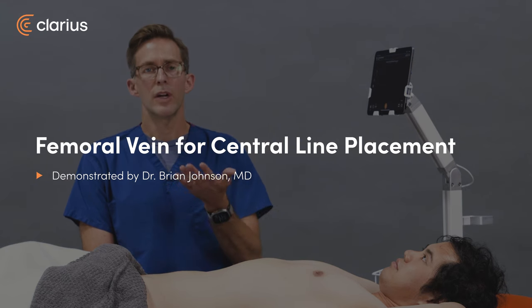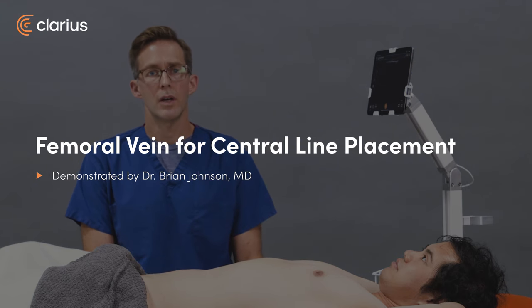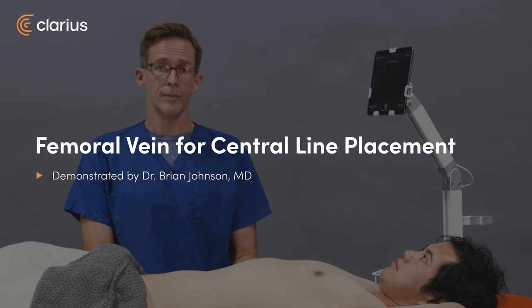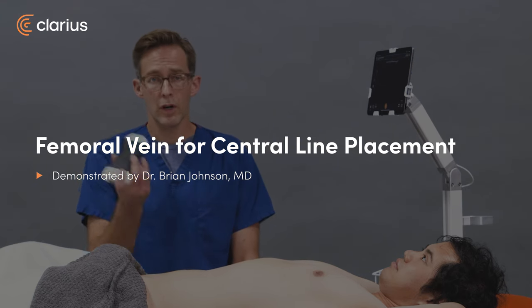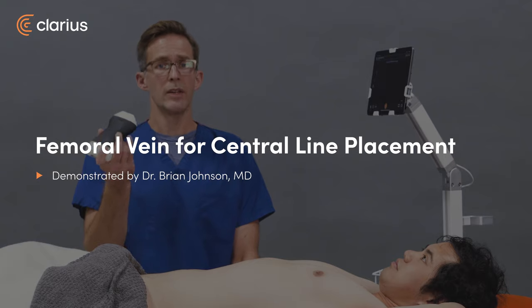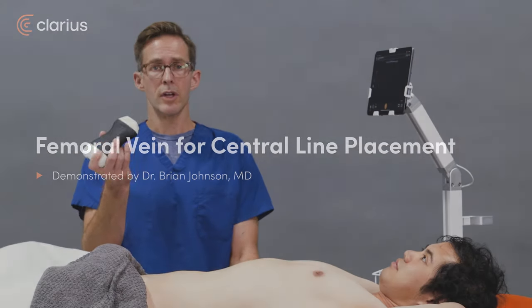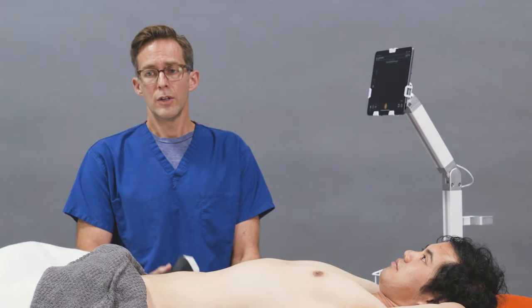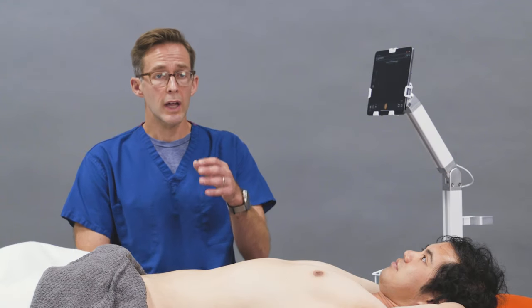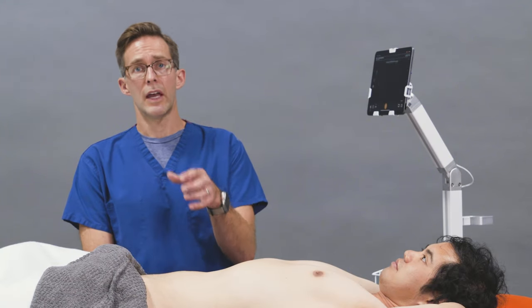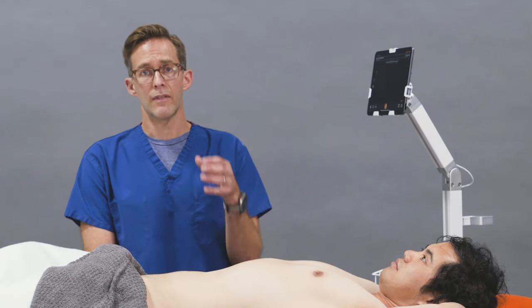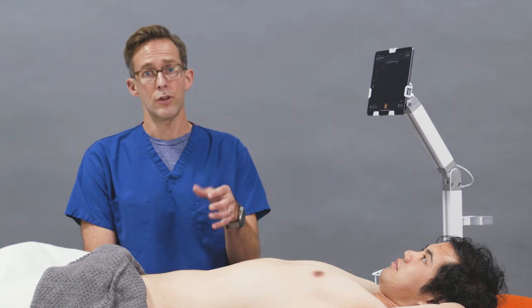Hello, I'm Brian Johnson. I'm an emergency physician. Today we're going to use the Clarius Pal ultrasound probe to visualize the femoral vein for a femoral central line.